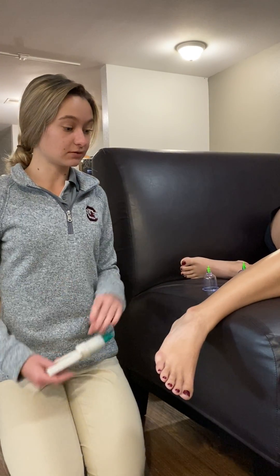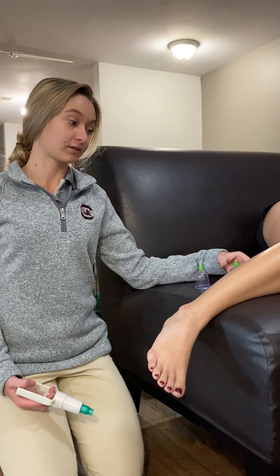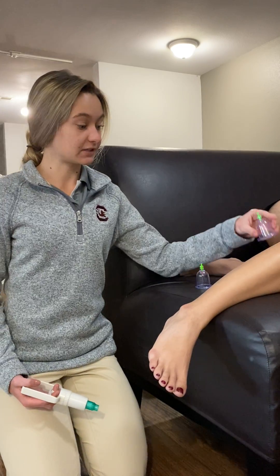We're going to do the lower leg on the peroneals, and this is especially good for runners, dancers, and people who have lateral ankle sprains to help them recover.